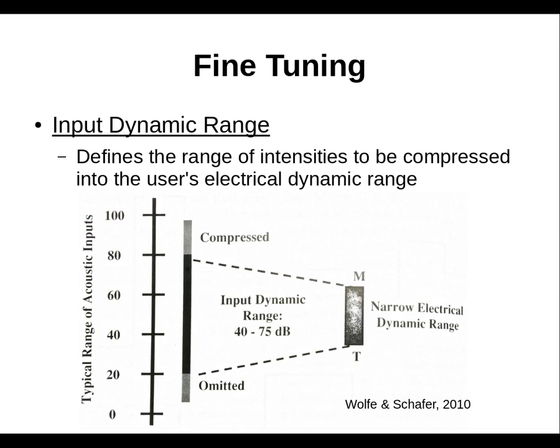And there's not really many speech sounds that are above 80 dB SPL, maybe 85 dB SPL for some of the back vowels, maybe some of the louder signals, but not much really above 80 dB SPL.